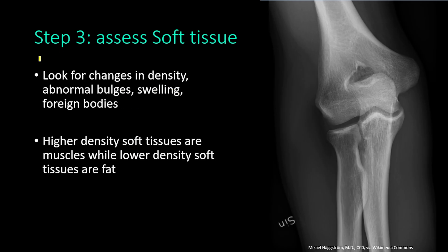Now moving to step three, which is the assessment of the soft tissues. In elbow x-rays you look for changes in density of the soft tissue, abnormal bulges, swelling, and foreign bodies. An important note: higher-density soft tissues are the muscles while lower-density soft tissues are the fat.